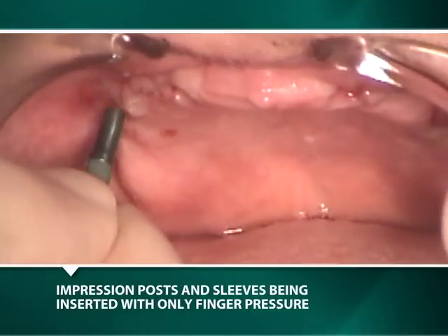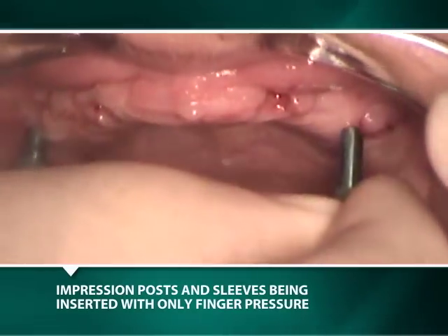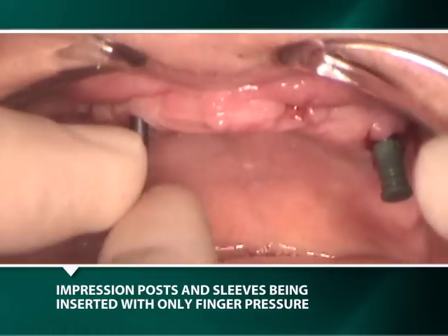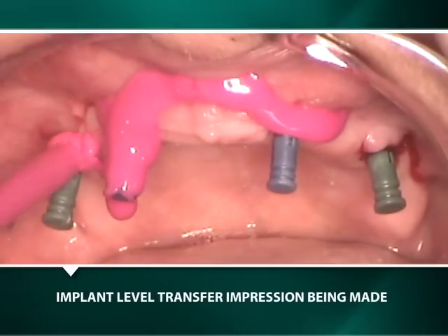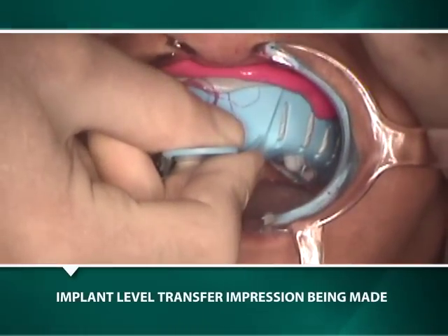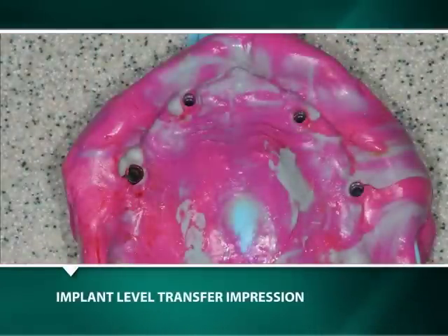Clinically, the treatment begins with an implant level impression by inserting with only finger pressure a red, blue, or green impression post with its corresponding acrylic sleeve into the respective 2 mm, 2.5 mm, or 3 mm implant well, prior to recording their position by making an implant level impression with any conventional impression material.